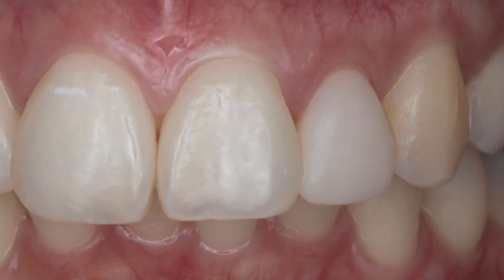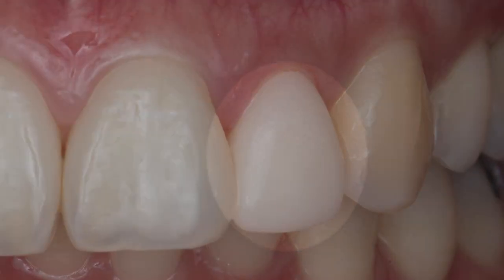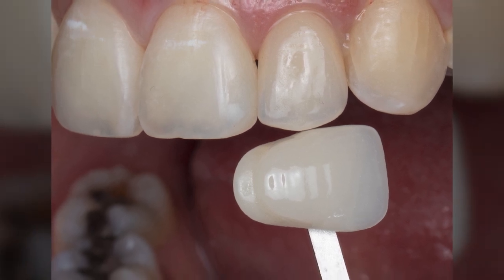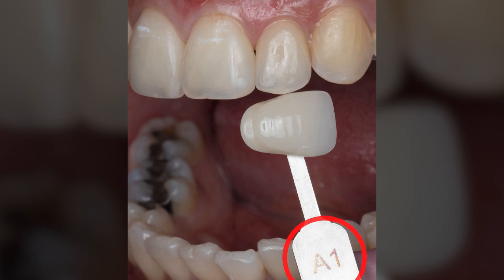At the next visit, Justine was happy with the appearance and fit. I was happy to see that her soft tissue had been groomed to close the black triangle between number 9 and 10. Together, we determined the desired shade for her final crown. We decided on shade A1 because it blended well with the surrounding teeth.